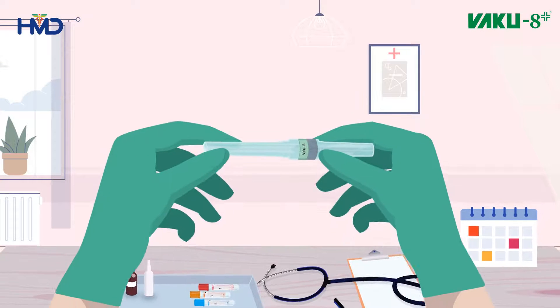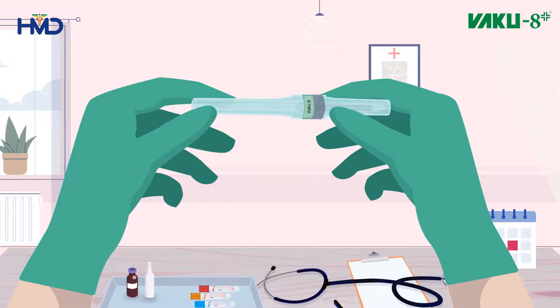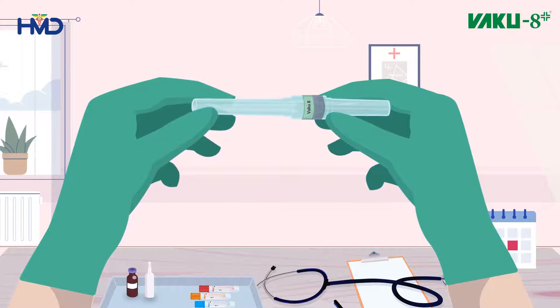Hi, I am Kathy. Today we will learn how to use VACU-8, an evacuated tube system which allows blood samples to be directly collected into the tube during a venipuncture procedure.